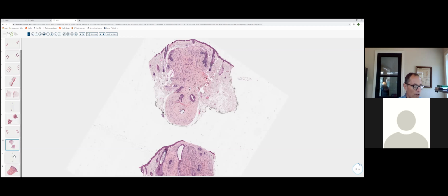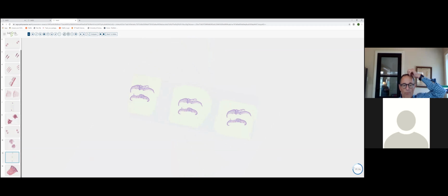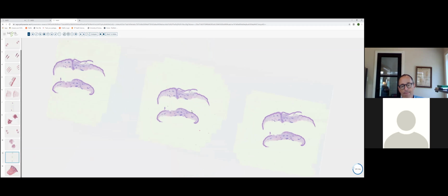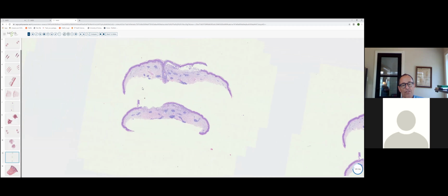Okay, let's go ahead and move on to slide 11. And we're going to close out here with a couple of neutrophilic blistering conditions, which bear some similarity to one another. So we have a bisected shave biopsy. And as we move to slightly higher power, you can see within the dermis, and this is probably from trunk or proximal extremity, there's a little bit of solar elastosis here.